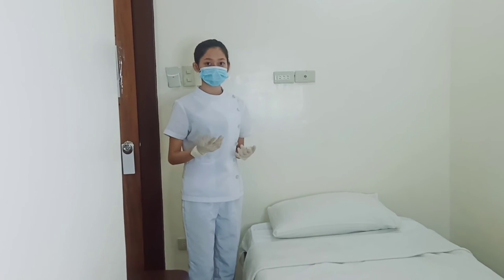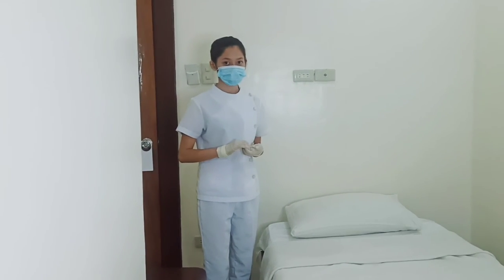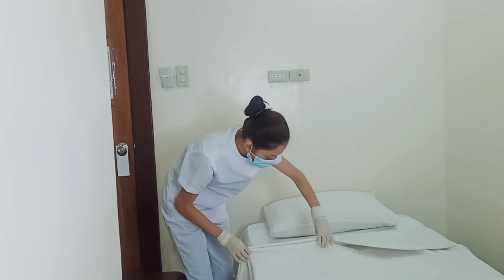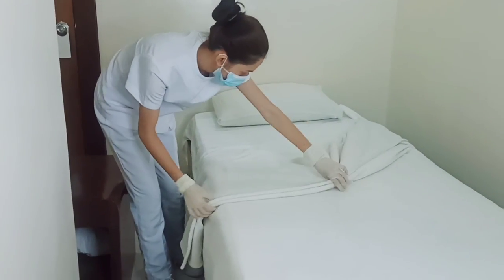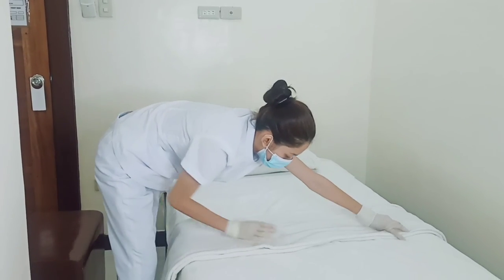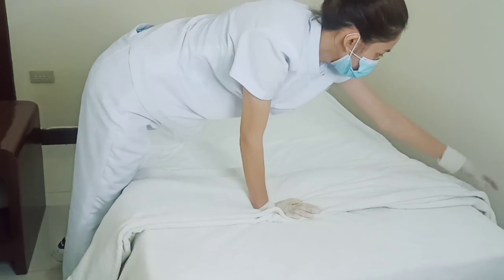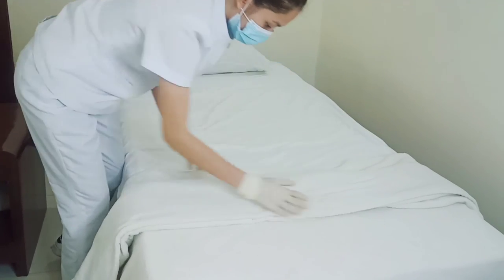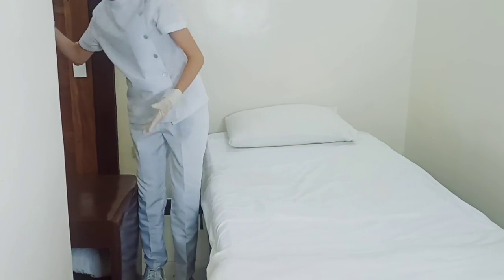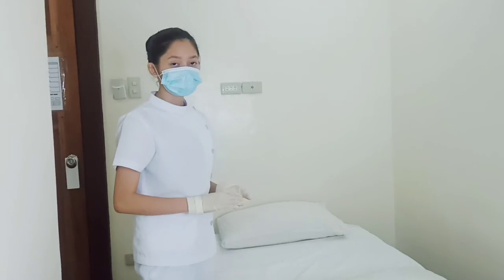Now I'm going to introduce to you the two types of bed: the obstetrical bed and the postoperative bed. The obstetrical bed is made by simply folding the top sheet and then another fold. I'm going to place the pillow at the center of the bed to support the knee part of the pregnant woman.